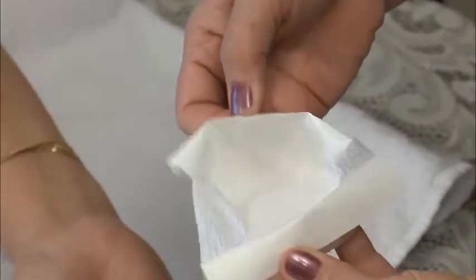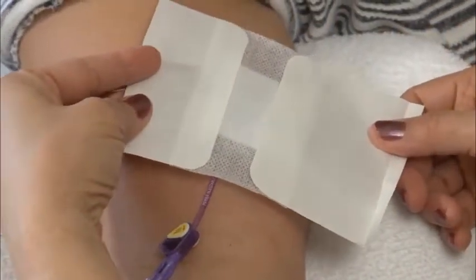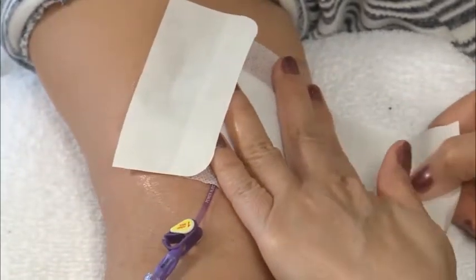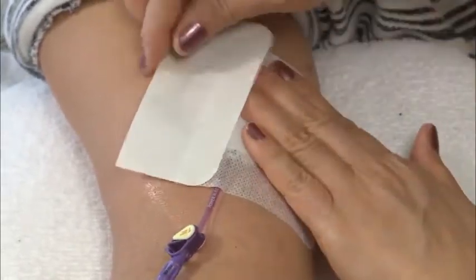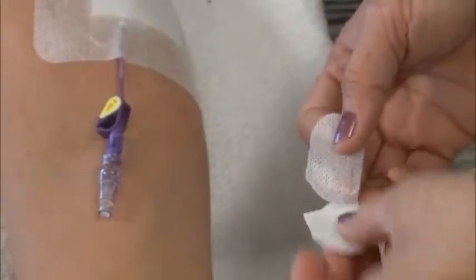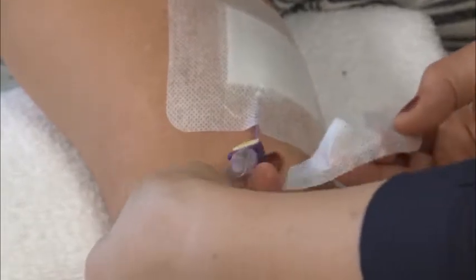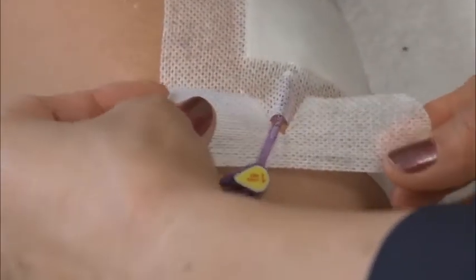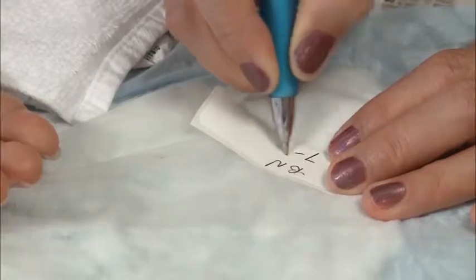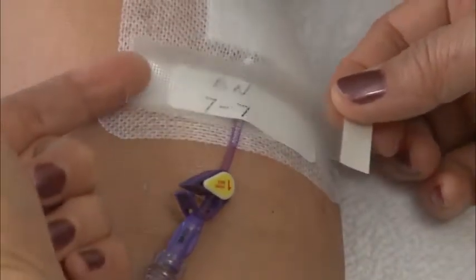Open the dressing and center it over the CVC. Pull off the tape edges to allow it to stick. There is a V-notch tape in the package. If your CVC has many extensions, you may need to make the V-cut bigger. Slip this tape up under the catheter extension. Slightly overlap the dressing. Press down. Write the date and your initials on the label. Place along the lower edge of the dressing. Cover it with a strip of clear plastic tape.